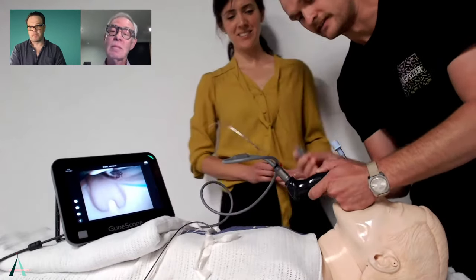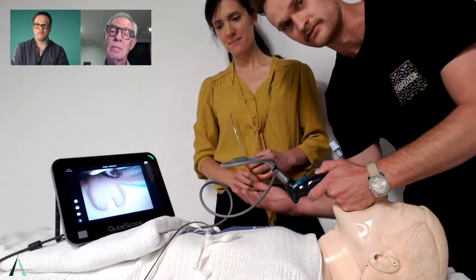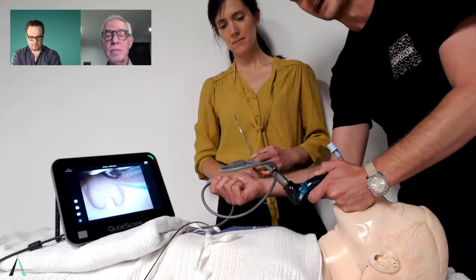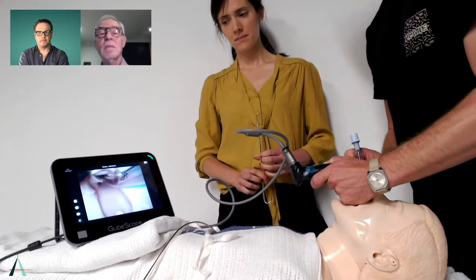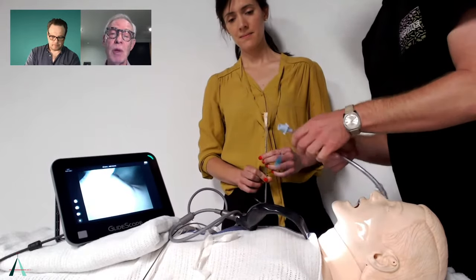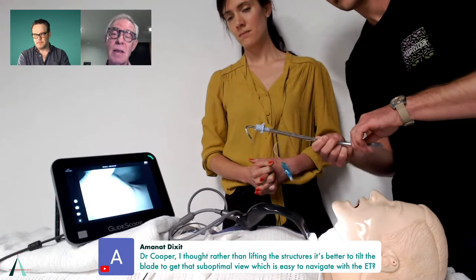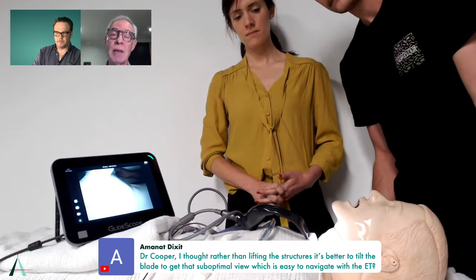The other thing we did have is inflation of the balloon prior to the removal of the stylet. I think in an intubation on road, in kind of an uncontrolled home setting, is it safer to have the balloon inflated before the stylet comes out, just in case you do dislodge it, or would you still recommend the stylet coming out prior to the inflation of the balloon? I don't have a comment on that. If you find in your practice that the tube is more secure with inflation prior to removing the stylet, go ahead. And I will say, in a pre-hospital setting? Yeah, in a pre-hospital setting. Well, that may be safer to do it that way.